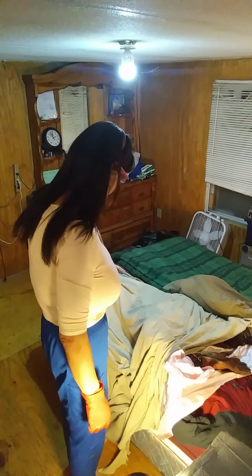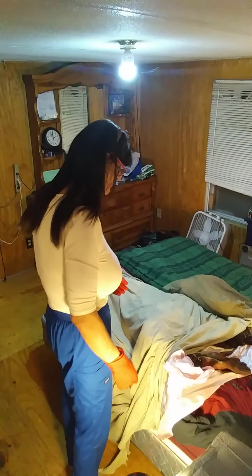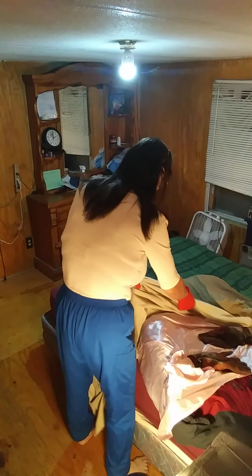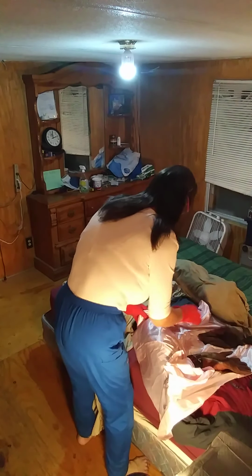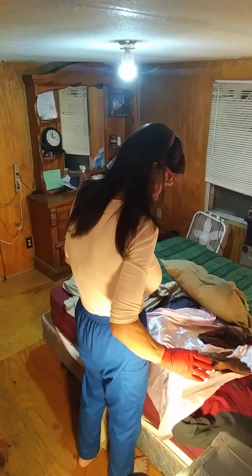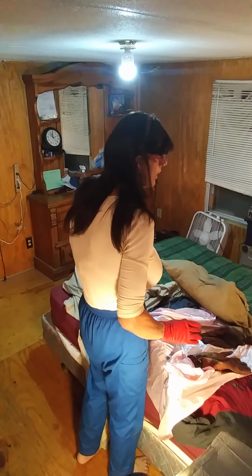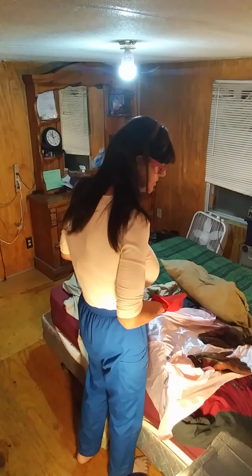Okay, Miss Cheswick, we're going to begin. I'm going to have to uncover your catheter, okay? So I'm going to put your blanket down to just above the knee. There you go. And I'm going to raise your gown just above the hip, just to expose your catheter, okay? What I'm going to do now is carefully roll you over on your side in a lateral position, and I'm going to put a linen protector underneath you. This way the sheets won't get wet when I do the catheter wash, okay?